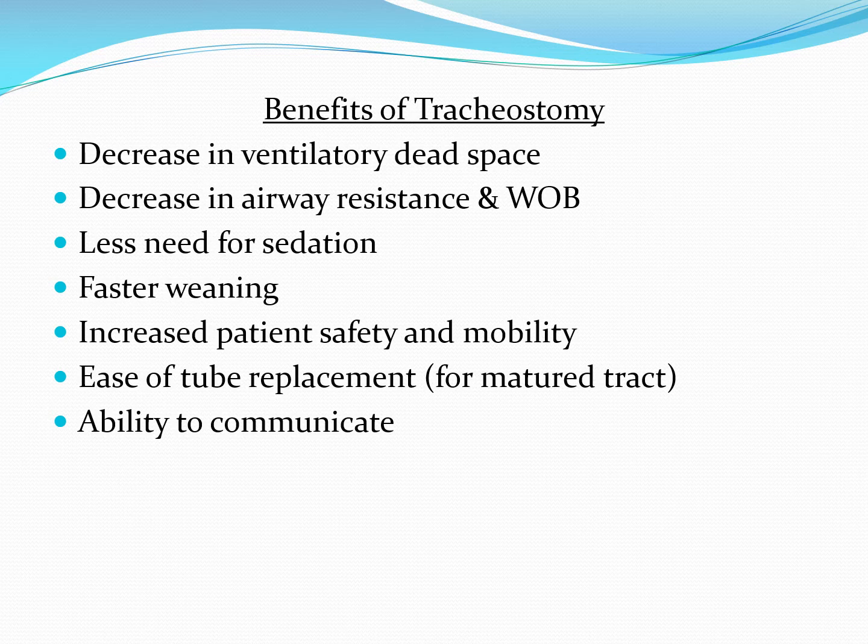Less need for sedation, and the mindset with less need for sedation is the whole fact that they're more comfortable. Once the tube is in place and has been established, that's the hard part. There could be some pain, discomfort associated with that, some bleeding, etc. But once that stoma is established, the trach tube would better facilitate the patient being able to eat, mouth care, being able to speak, and just potentially being more comfortable than having an endotracheal tube in their mouth.